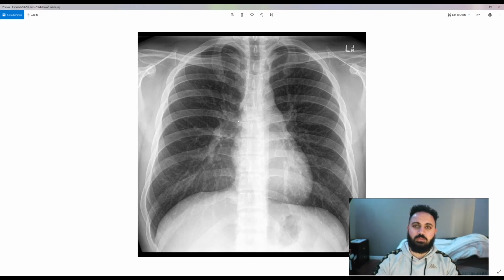I think that we can do more of these types of interpretation films in the future if this is something that you guys like. And we can do them more with pathologies, because we haven't talked about ICU type films where you're looking at all the lines and tubes that might be in a chest x-ray that are hard to identify, but it's something that takes practice getting used to, as well as cardiac pathology and surgery that's involved with the chest. You need to be able to recognize them and have an approach to reporting.